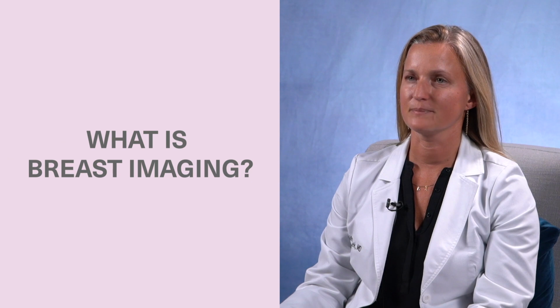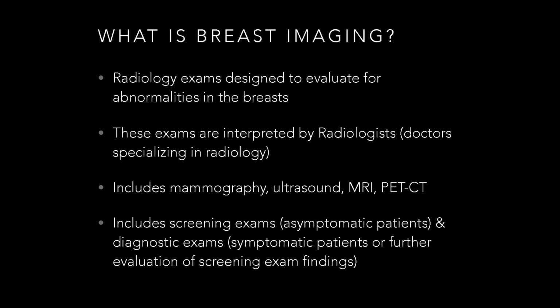What is breast imaging? We're talking about radiology exams, which are designed to evaluate for abnormalities in the breast. These exams are interpreted by radiologists who are doctors specializing in radiology. These exams include mammography, ultrasound, MRI, and PET-CT.